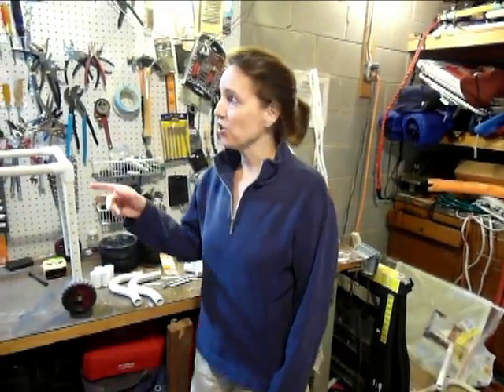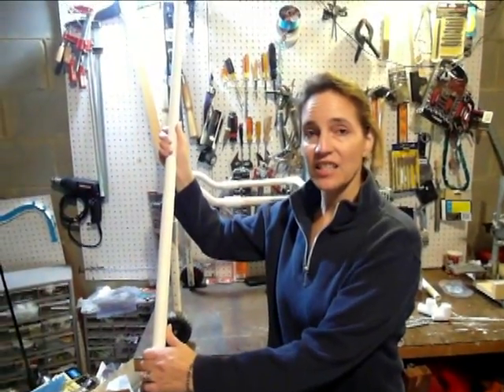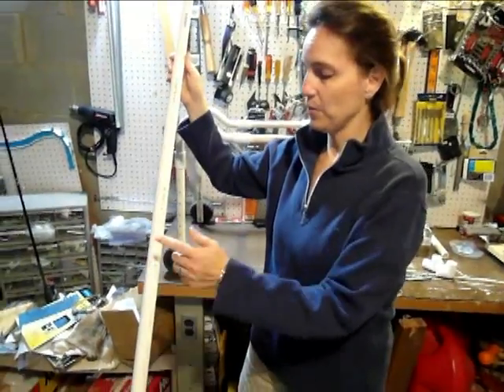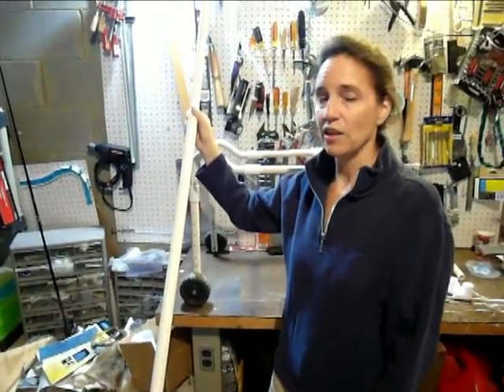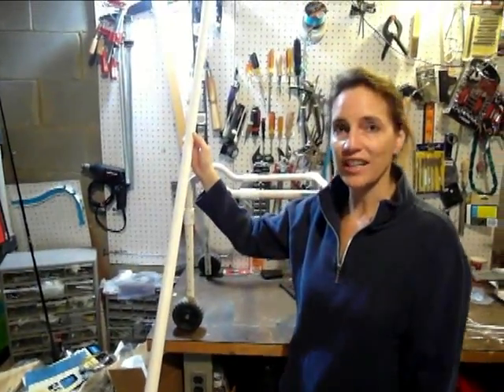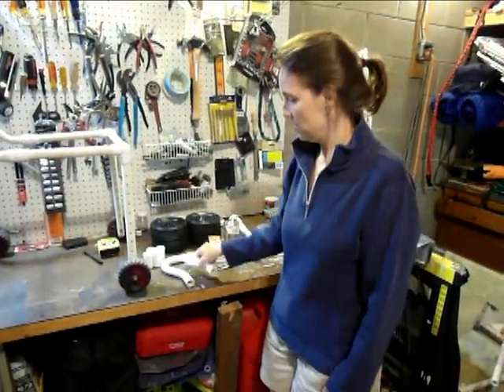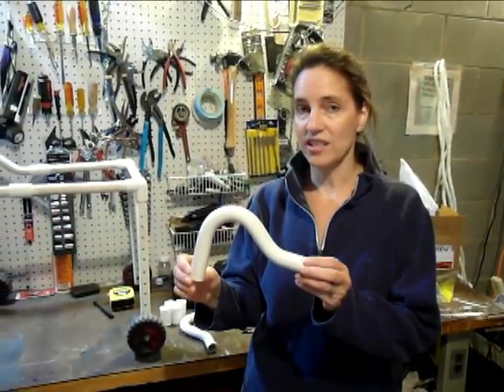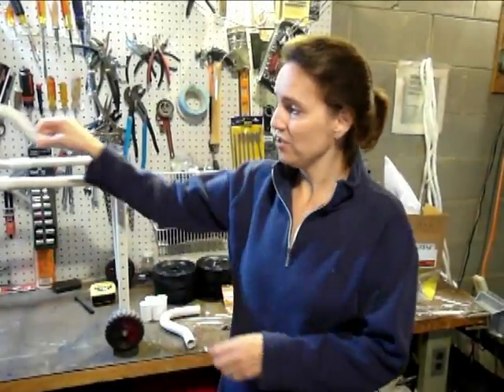Let's go over some of the parts that we'll need to build the walker. The major first part is the pipe — it's a 3/4-inch PVC pipe. This particular piece is about 10 feet long. You get it at Home Depot, or Lowe's, or any hardware store like that. Next, this is also a 3/4-inch pipe — it's a condensate trap, and I've discovered that it makes very nice handles for the walker.